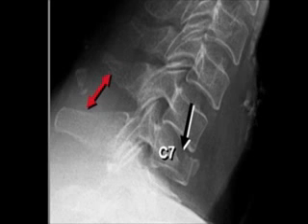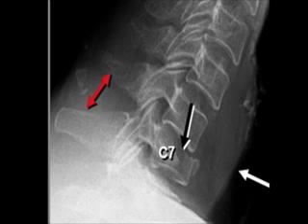You can also see that the distance between the spinous processes of C6 and C7, indicated by the red arrows, is increased. There is soft tissue swelling anteriorly.